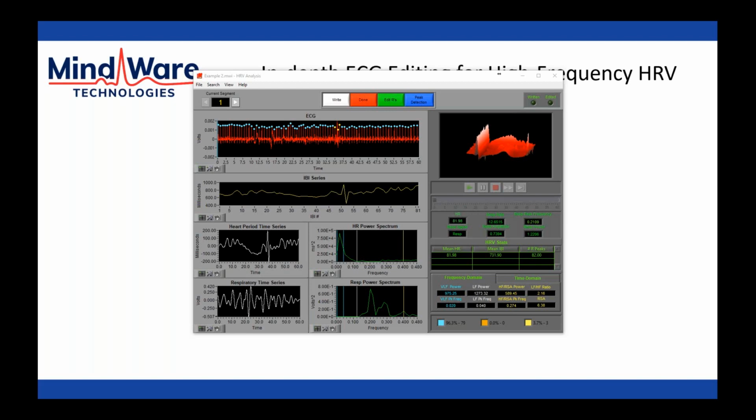And as long as you're analyzing in 60-second segments, hopefully that means that you're removing less data than you're keeping, and that would mean that you could still use that segment for your statistical output. But if it occurs in the middle, or if you're using smaller segments, then you probably just have to discard that segment.